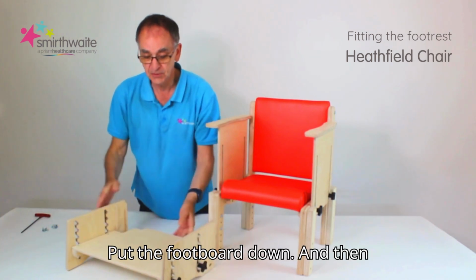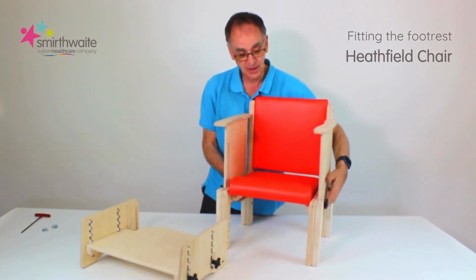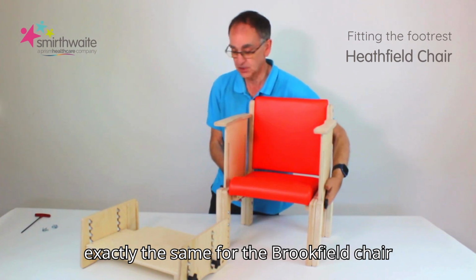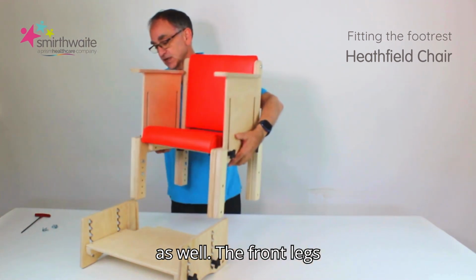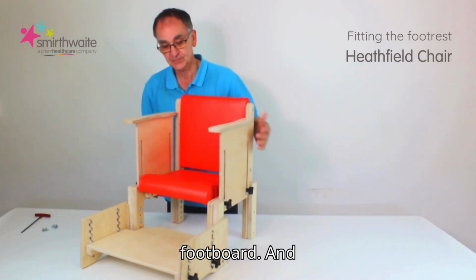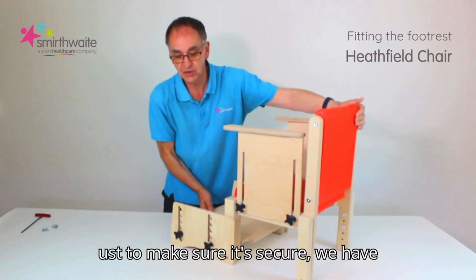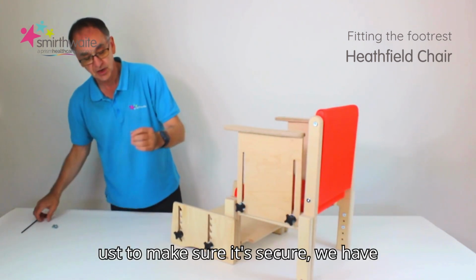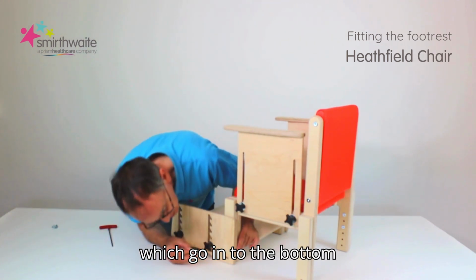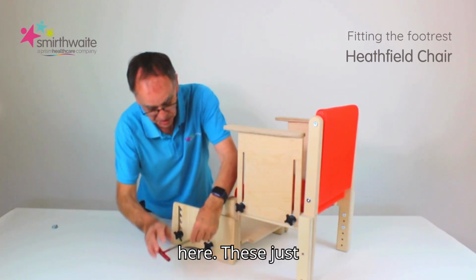Put the footboard down and then lift the chair itself. This is a Heathfield, but it actually is exactly the same for the Brookfield chair as well. The front legs simply slot into those channels on the footboard, and then, just to make sure it's secure, we have 2 4mm Allen key bolts which go in to the bottom here. These just need tightening.